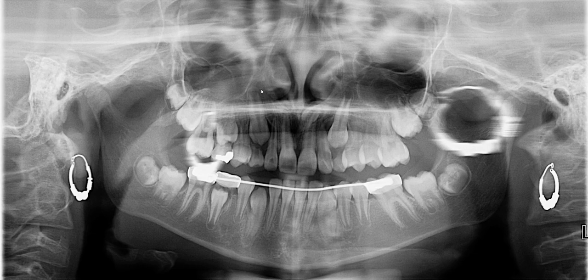Hi class, I have another question for you on this panoramic radiograph. My question is, can you determine the age of this patient? And how do you go about determining the patient's age?